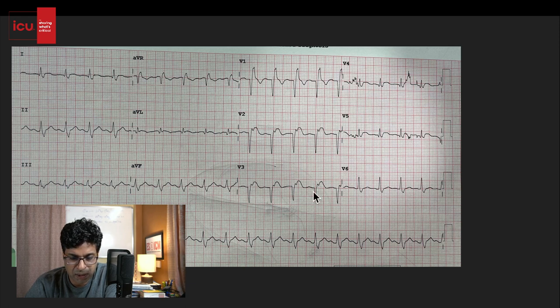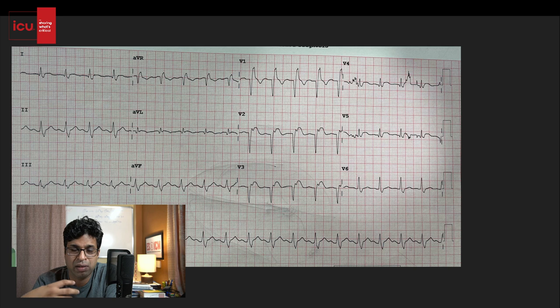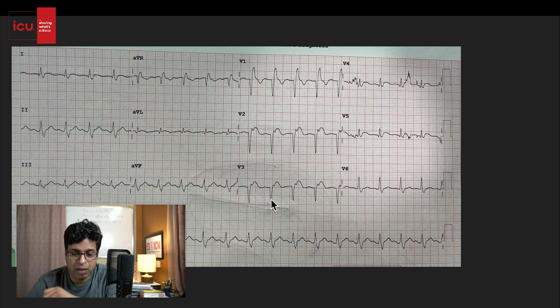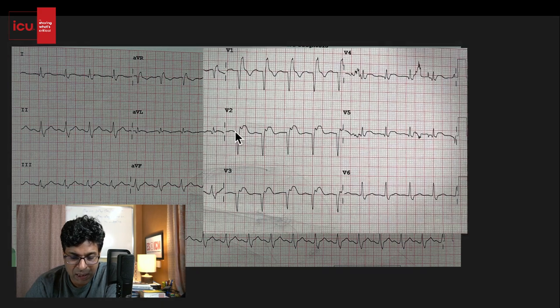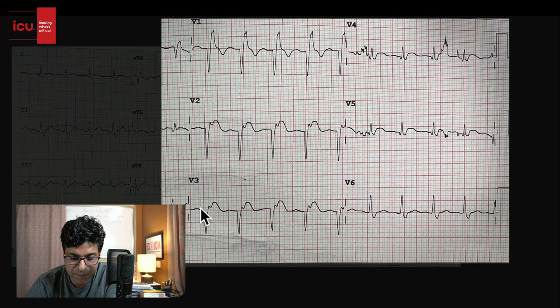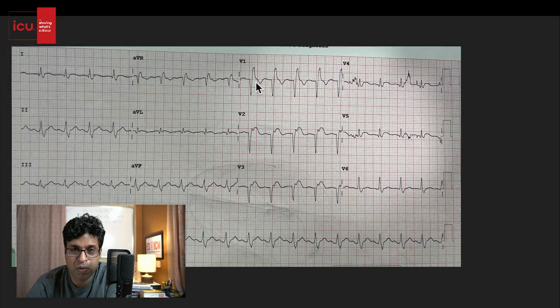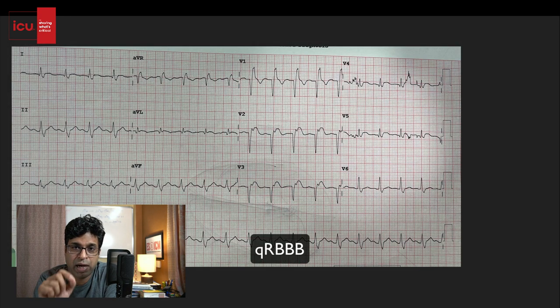Looking at this ECG, you can see ST elevations here. This patient had classical symptoms of chest pain, perspiration, and all classical symptoms of MI, and the ECG also showed ST elevation — so it was a case of STEMI. Importantly, there are Q waves in the anterior leads, a right bundle branch block pattern positive in V1, and an S wave in V6. We call this the QR-BBB pattern — Q waves with right bundle branch block.